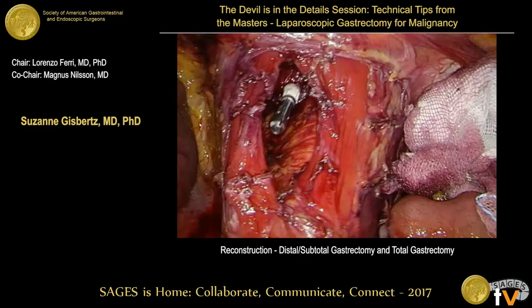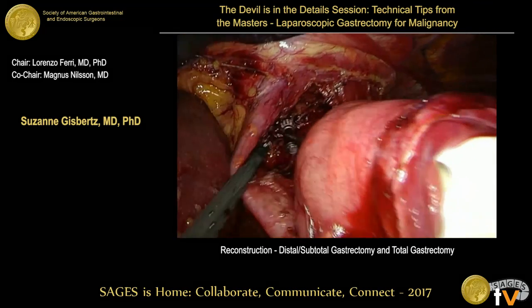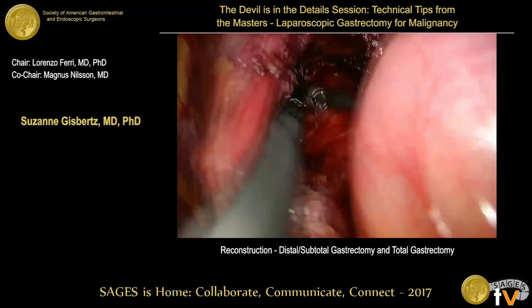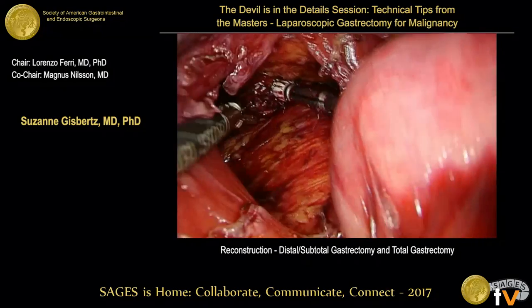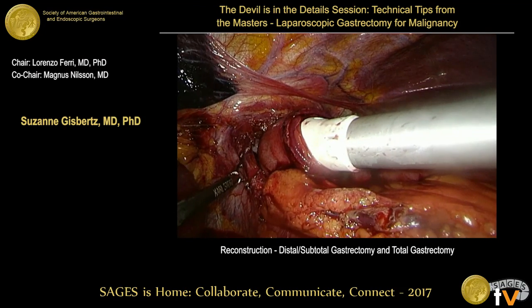It's considered a very good tip to prepare the jejunal loop outside the abdomen, especially when you need a long loop. It would be very difficult to prepare laparoscopically, particularly in obese patients.